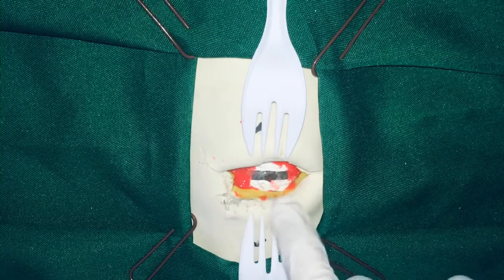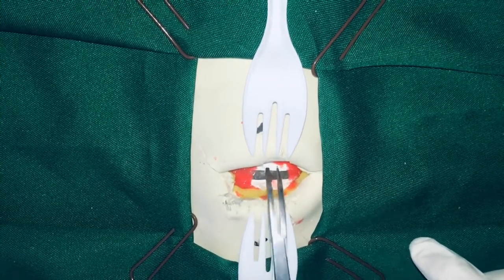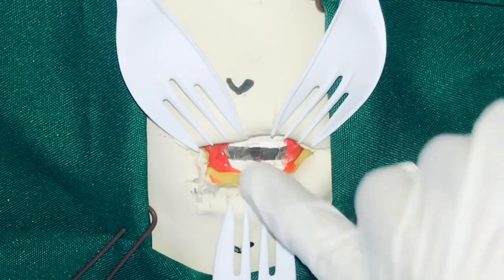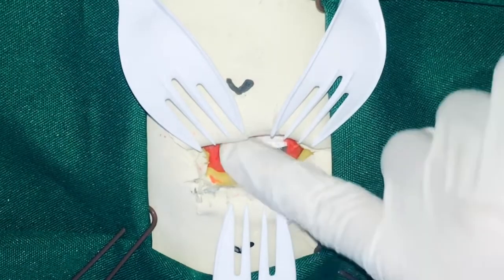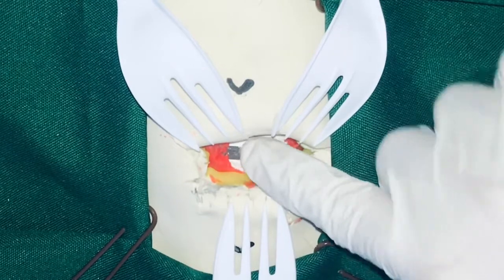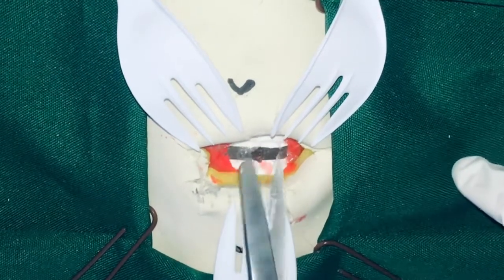Once the fascia has been cleared, identify the strap muscles and retract them laterally. Divide this intermuscular plane by spreading with a pair of scissors. Sometimes, the isthmus of the thyroid is encountered over the second and third tracheal rings. Retract the isthmus superiorly with a Langenbeck retractor to expose the trachea. The trachea and cricoid can now be palpated. Divide the pretracheal fascia with a pair of scissors.